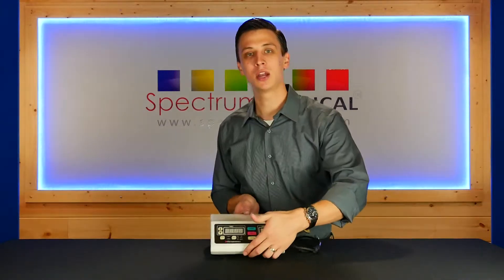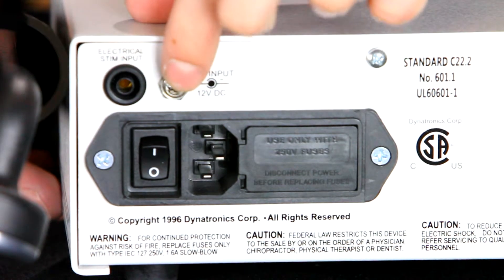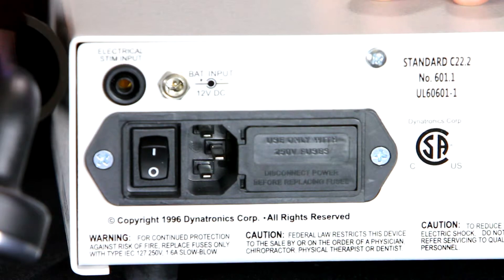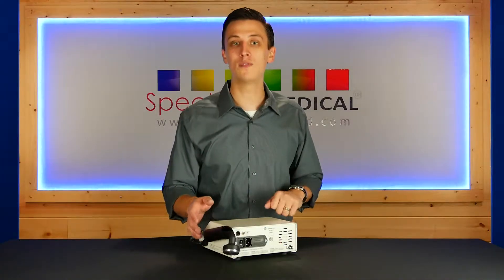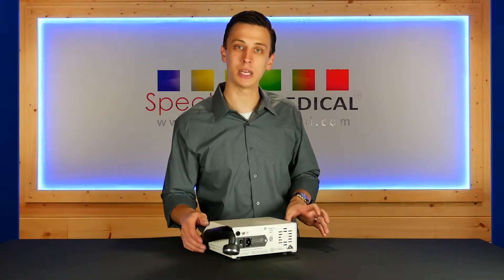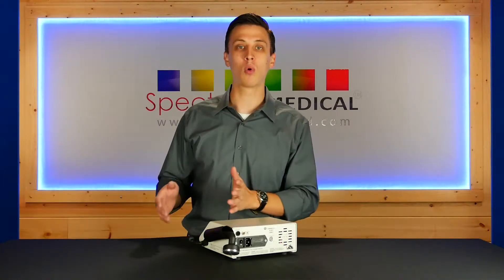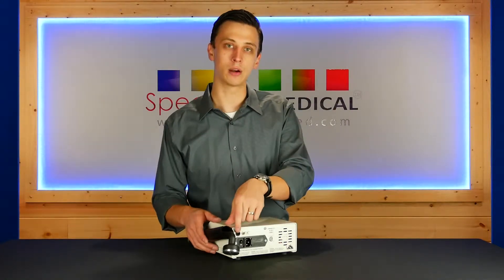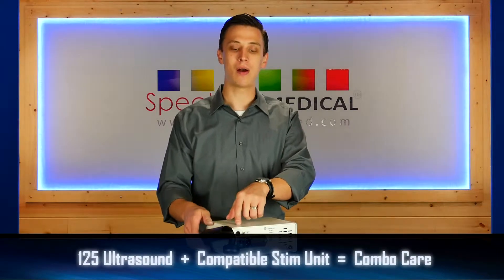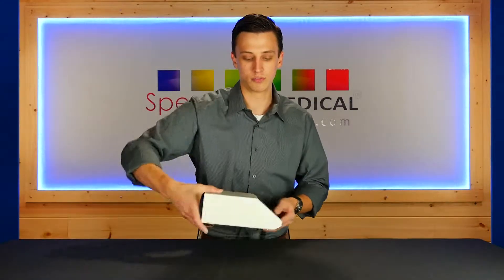On the back, they've given you an optional battery add-on. You'll have the ability to plug in a remote battery source so that if you need power while on the field or on the road. Also, if you have a stim unit in your clinic but you're wanting to do true combo therapy but don't want to spring for a combo unit, you can get this unit and use a jumper wire to bring that stim over and now have true combo therapy through this ultrasound head. Let's flip it around to the front.